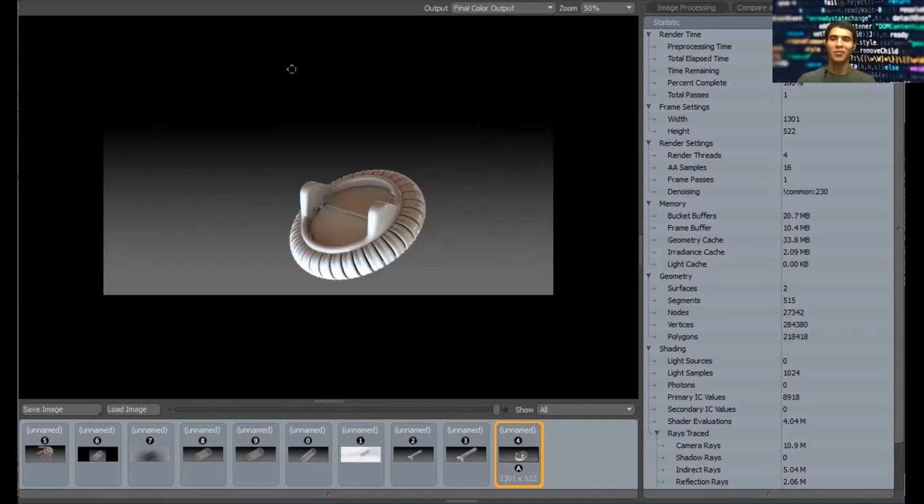So that was really quick, and I was impressed. Yes, it was. It usually takes at least 10 minutes. But this is how your render would look like at the end. I think what went is that the render quality might have been lower than usually. By the way, this is nice. This would be your final product. For most of senior design, you would get the render. Or let's say you want to make a quick design, you would render it.